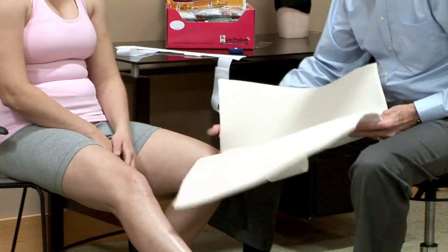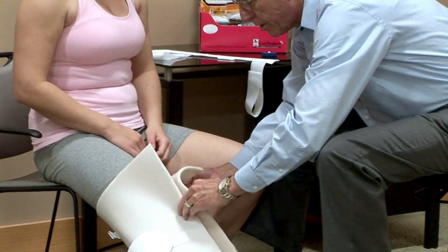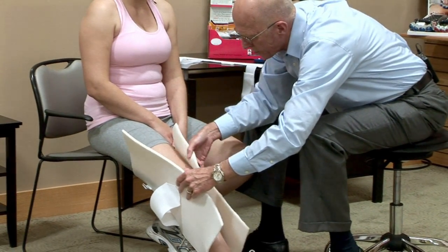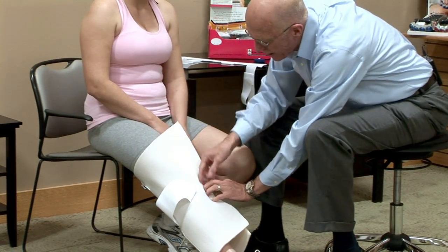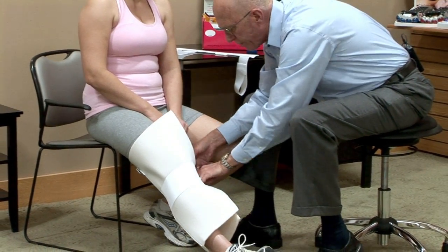Go ahead and extend your leg and put it down. Making sure that it's contoured to her calf area. There's just a simple closure here to keep the garment on and put a little bit of pressure right over the knee area.